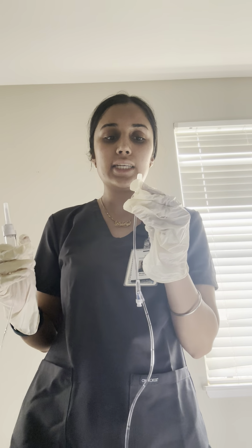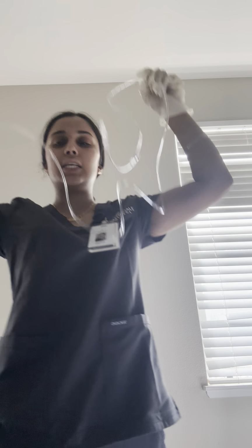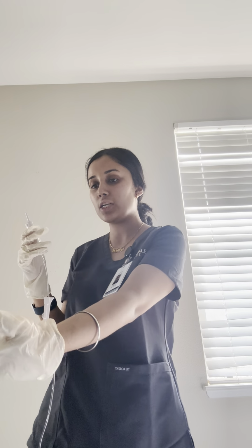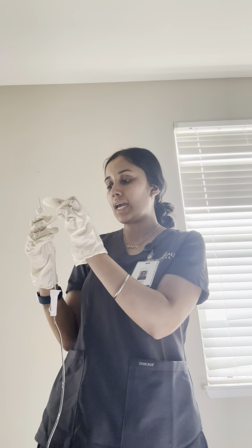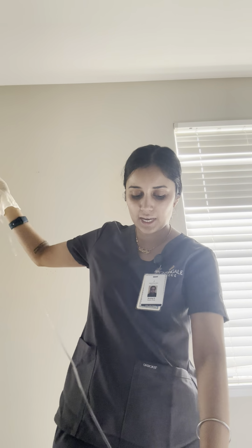This is the port that is connected to the secondary piggyback line. We want to make sure that this is sterile at all times. And then this is the part that is connected directly to the patient's IV. This is my secondary tubing that I have. It has the same components as the primary tubing, the spiking, the drip chamber, the clamping, the tubing in itself.